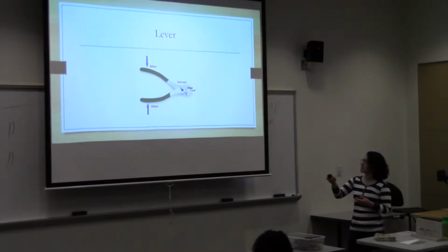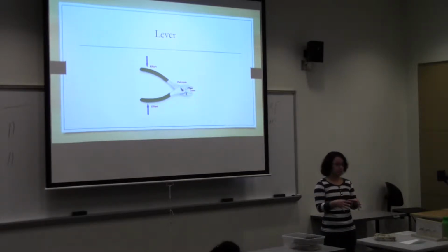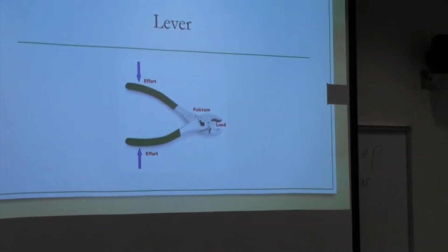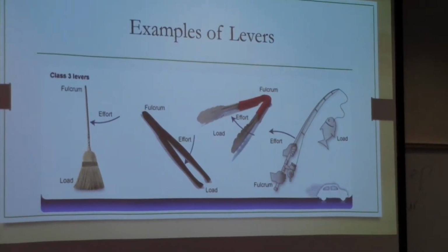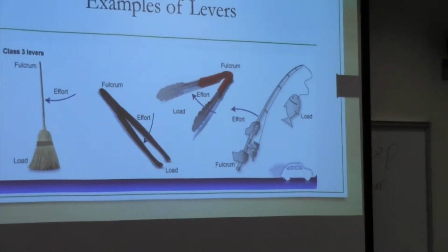So just some basics for the 3 points that you want to identify when you start building the gripper are these 3 points: the fulcrum, where you're going to apply the effort, and the load, where it's actually going to pick it up. So the fulcrum in something like this is going to be a pivot point, and it's going to be where it attaches to the body, where you're going to reinforce it to the body. But this is just an example. It doesn't always have to be a pivot point. Like for tongs, for example, it's just where the end where it lays.